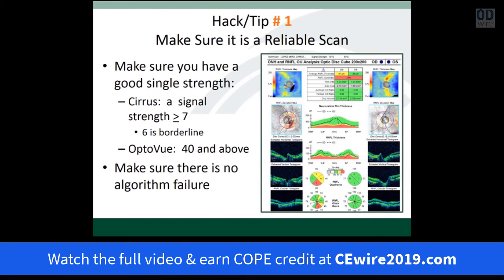Hack tip number one: make sure it's a reliable scan. We're looking at a Cirrus OCT here. The first thing to look at — whether it's a Cirrus, OptoVue, or any technology — is signal strength. On the Cirrus in particular, a signal strength of at least seven or over is important. A six I would consider borderline. When deciding if a patient has glaucoma or identifying progression over time, it becomes more important to have a good, reliable scan.